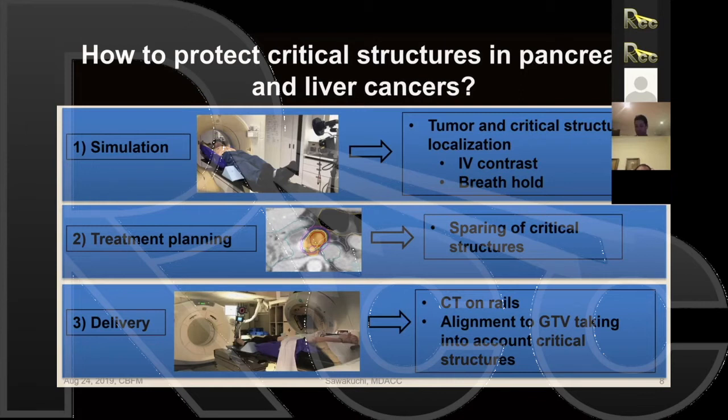And that can help reduce some of the crosstalk that you can see that results in poor soft tissue contrast from, say, a typical cone beam CT. But all that said, the newer cone beam CT machines that are coming out these days do have various features that can help improve noise and soft tissue contrast.